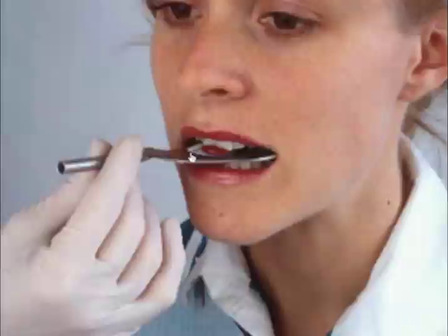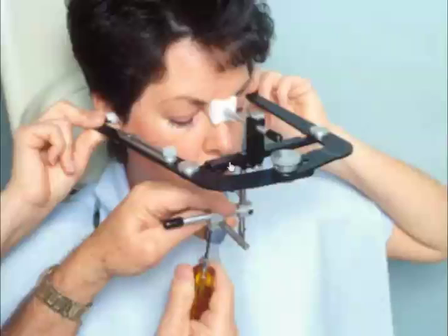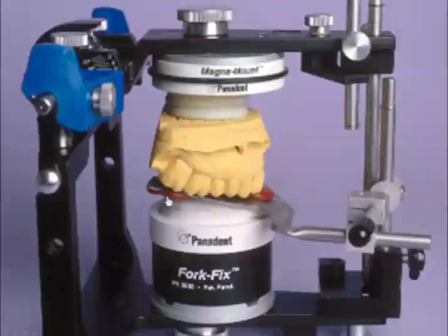We first take a bite fork registration of the patient's maxillary teeth, which is picking up the plane of occlusion. Then we add the face bow, where the upper surface of this face bow is related to the plane of reference. Again, we're referencing to an arbitrary relationship of the axis using the ears. Then we're referencing 22 millimeters below nasion, where the average canthus of the eye is, setting up the axis orbital plane of reference. Connecting the clamp to the bite fork connects the two planes together. So when we go to the articulator, we'll get the plane of occlusion as it relates to a plane of reference on the articulator. Now this may or may not be aesthetically correct, but it will be functionally correct.